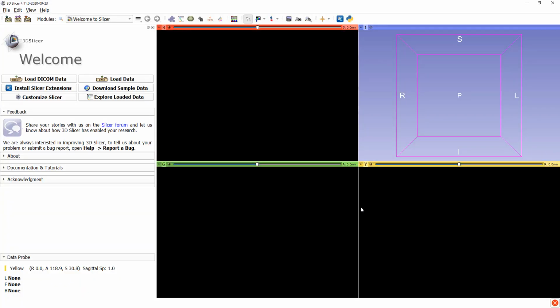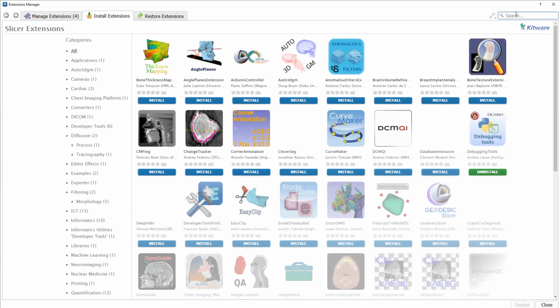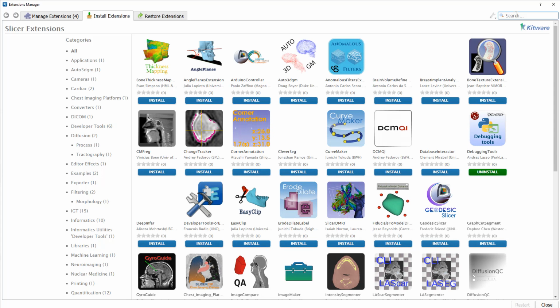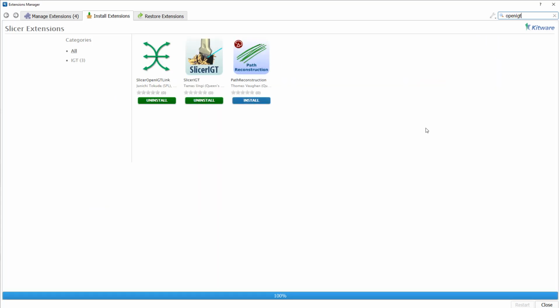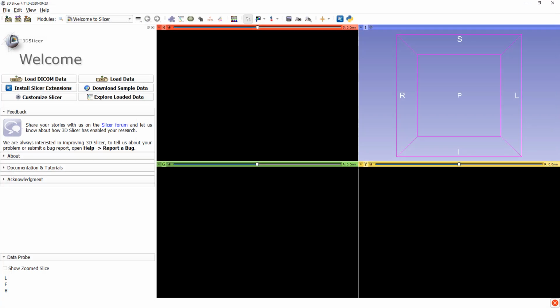Once all this software is installed, Slicer and Plus, we still need to install some Slicer extensions. The easiest way to find them is to search for OpenIGTLink. OpenIGTLink is the communication interface. I've already installed it, so I don't need to press install here. The other is the SlicerIGT extension that we are going to be using. And the third one is IGSIO, which contains the 3D volume reconstruction.